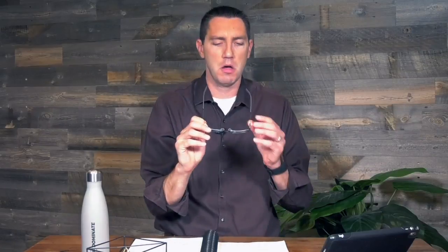And they say, oh, I'm an optometry student. And they go, oh, yeah, great. I'm wearing glasses, but I'm really confused on whether I'm nearsighted or farsighted. So can you help me out with that? And you don't want to ask them all these questions. You just want to go, okay, and they hand you the glasses. Like, can you just tell from my glasses? And you go, yes, I can. It's called hand neutralization, right?